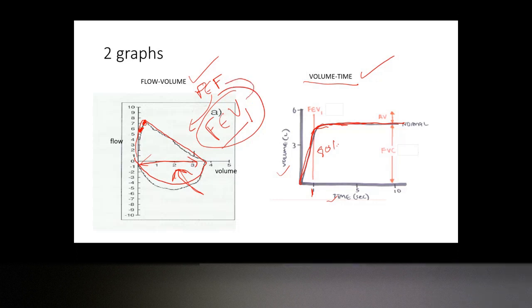Are you talking about the density of the dots? I remember that the frequency of the dots was telling us the time. Professor Kubichak asked us. The density of the dots, the frequency of the dots, tells us the time.